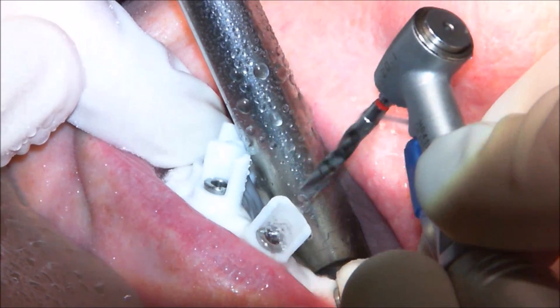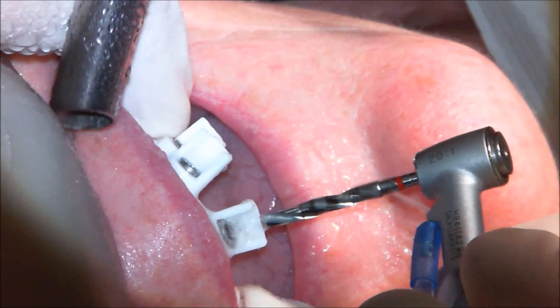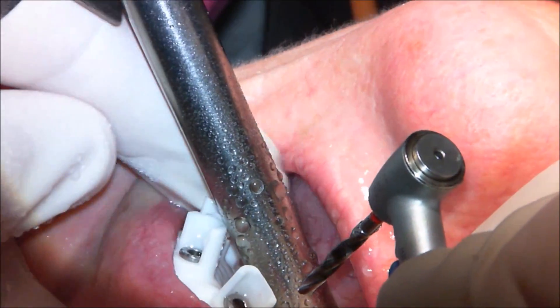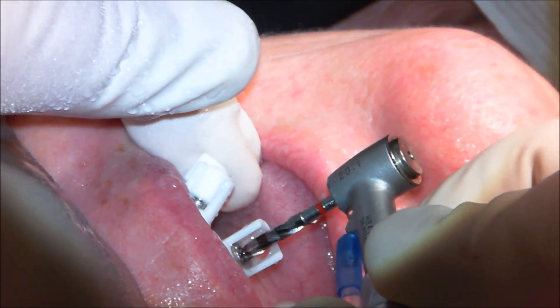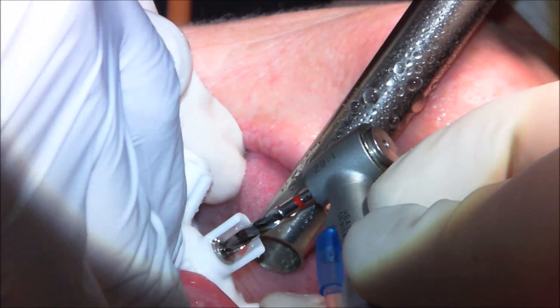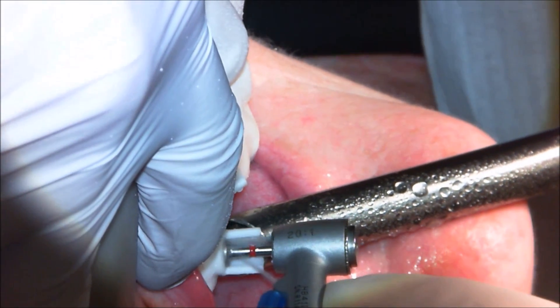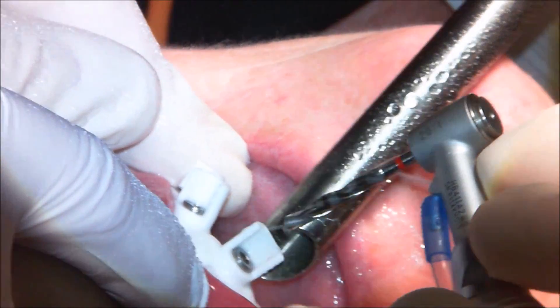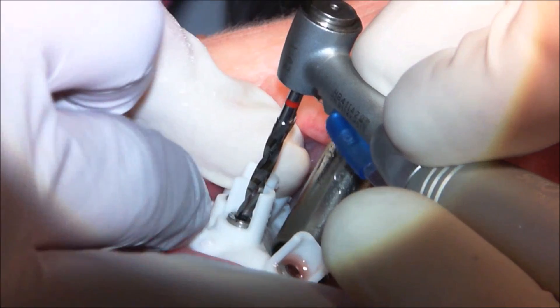We use lots of pumping motion to keep plenty of water in there and avoid overheating, and to clear bone debris as we go. It's a very simple process — we just sink the drill until the handpiece bottoms out on the guide drill stop. From there we move to the next site with no need to remove the guide.